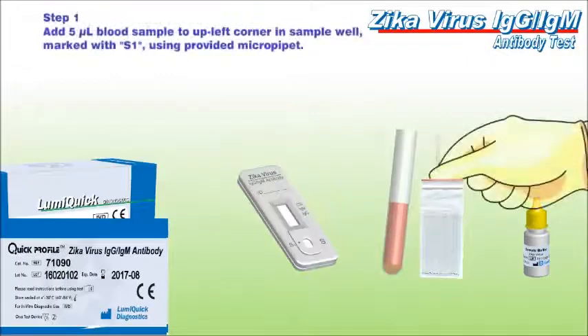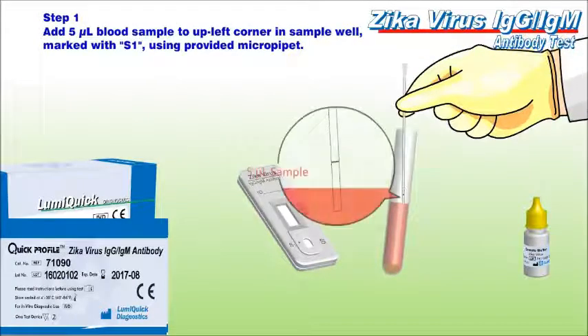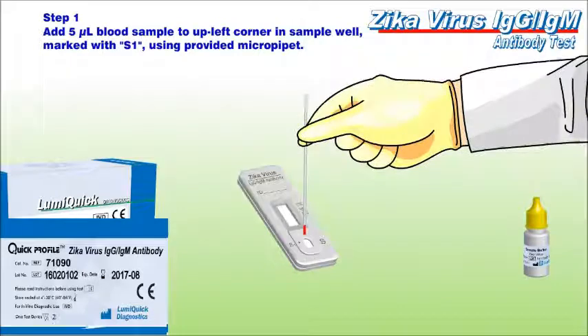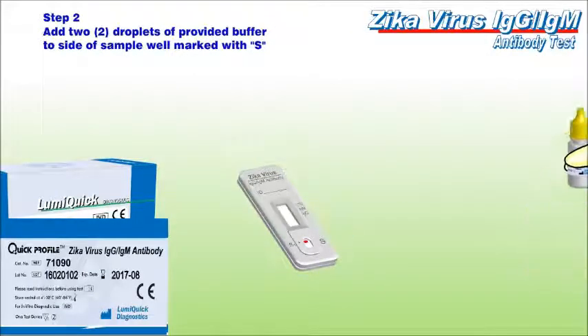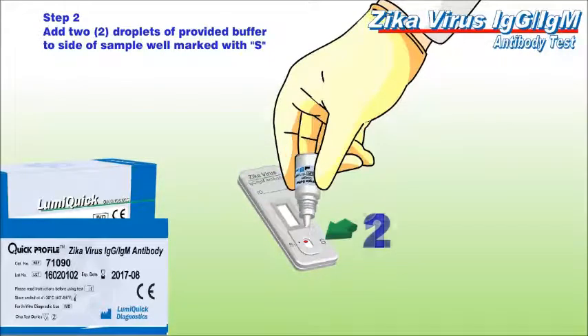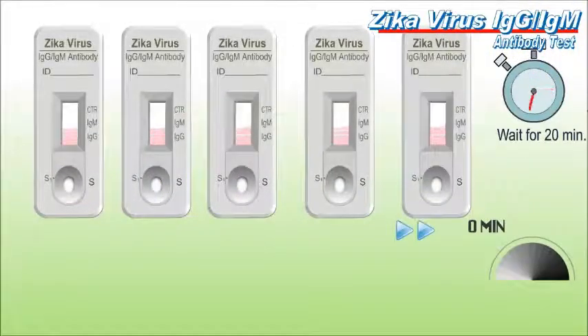With the provided micropipette, apply 5 microliters of serum, plasma or whole blood to the area indicated by the arrow mark. Add 2 drops of sample buffer to the well marked S. Start the timer and read results at the end of the 20th minute.